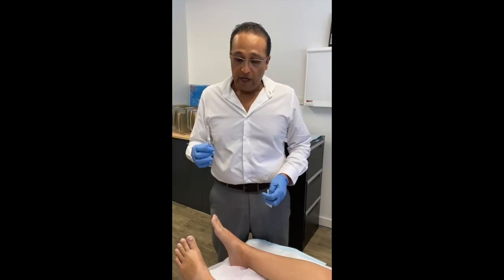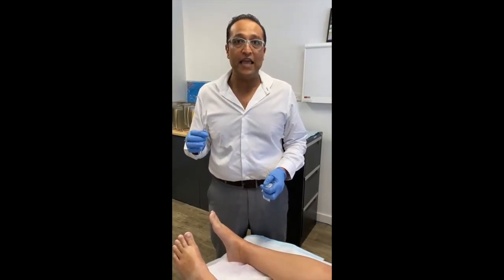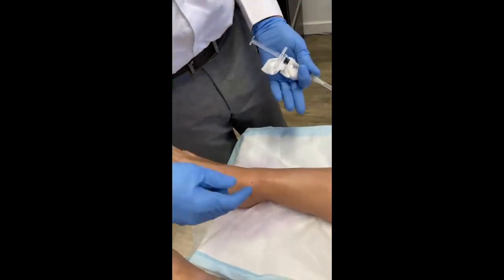Today I'm going to take you through how to give an intra-articular injection into the ankle joint. We'll begin with some surface anatomy — this is a patient lying flat on their back.